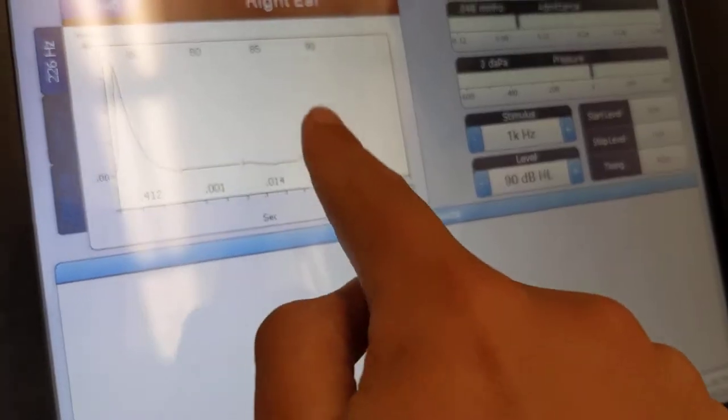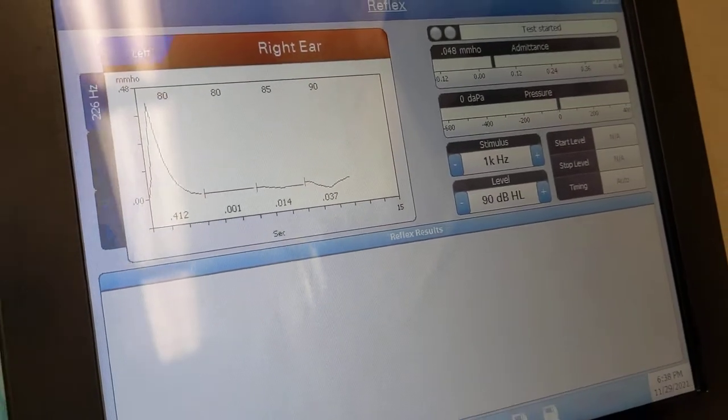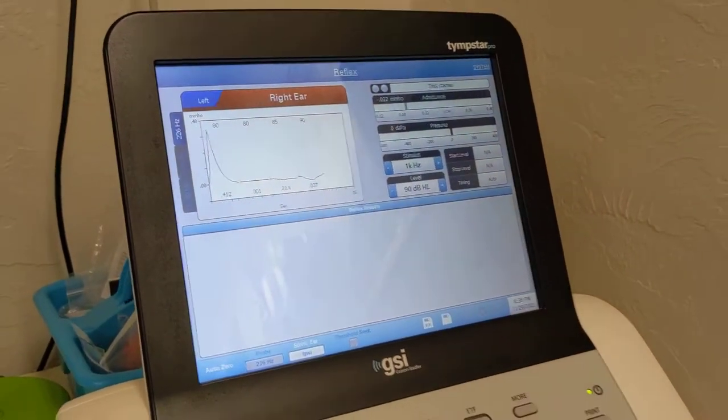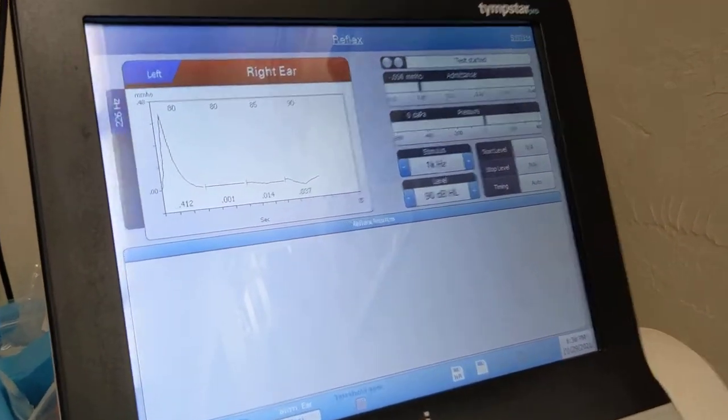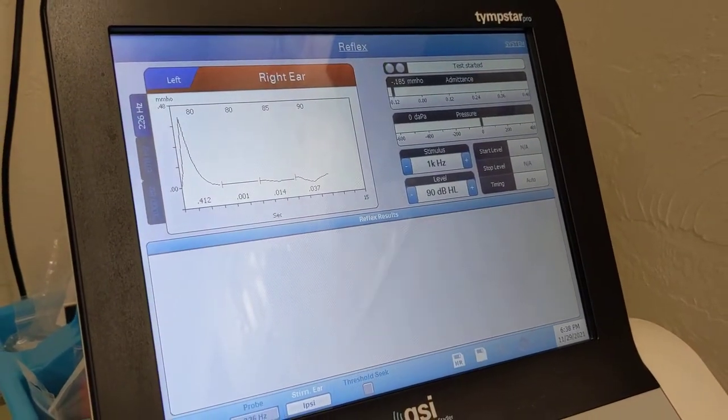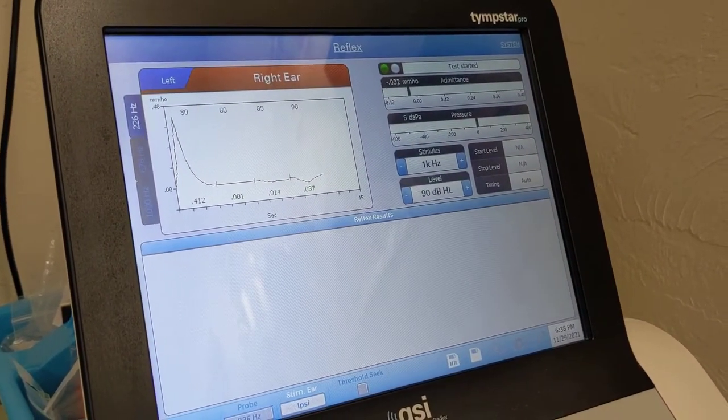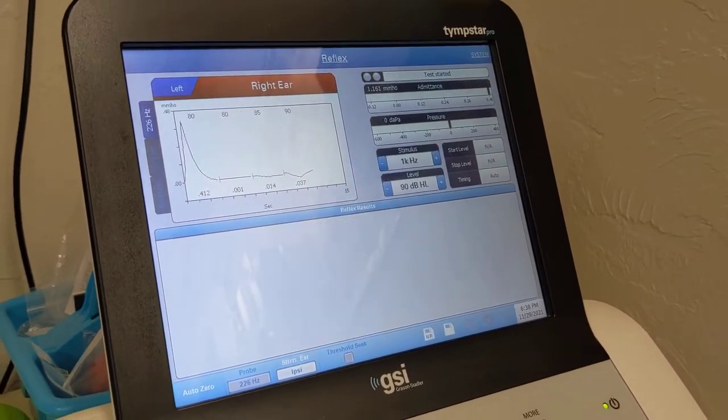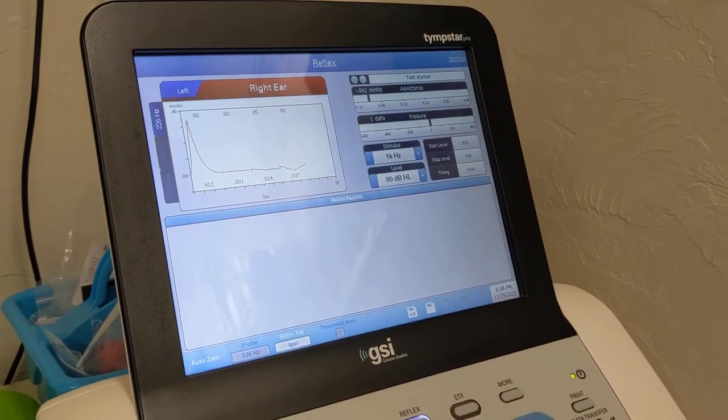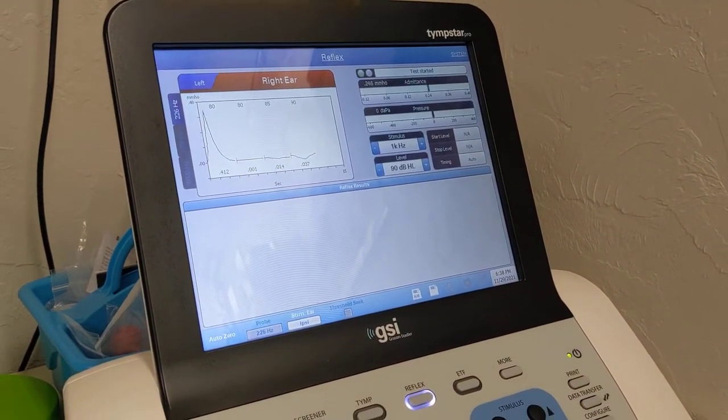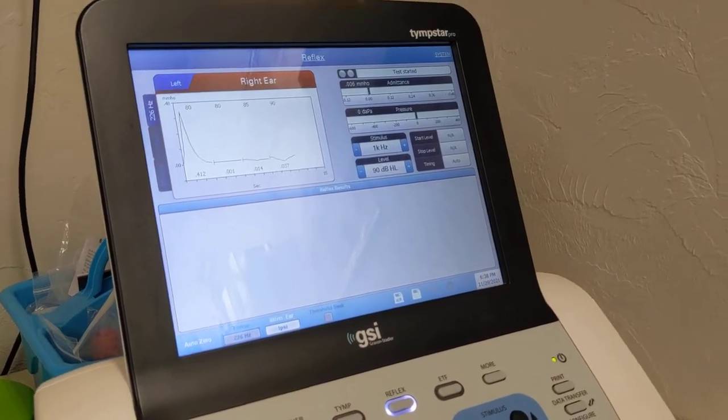so as you can see here at 90 dB, we have 0.03. So that is higher than the 0.02, which means that I have a present reflex in my right ear, since we are doing Ipsy.